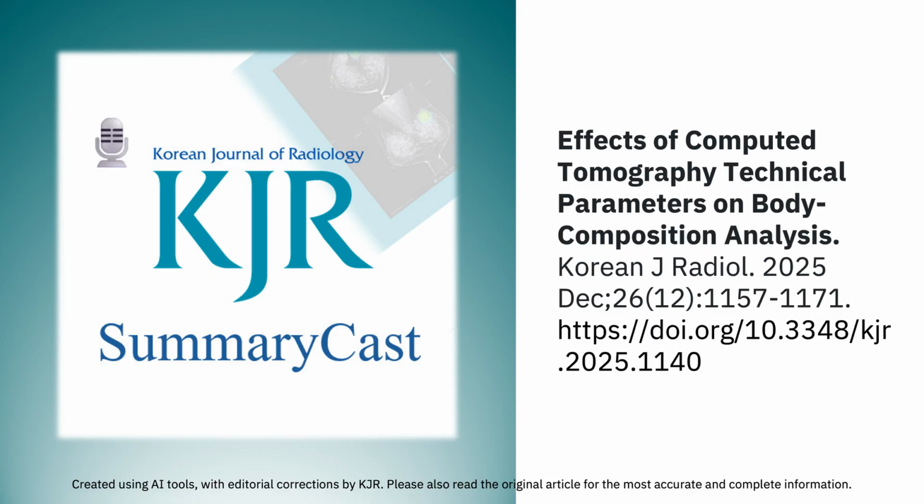The takeaway seems to be pick one phase and stick with it for any longitudinal analysis. Okay, let's move to another major factor, radiation dose, starting with tube current. Right, the mAs. The clinical push is always to lower the dose, which means lower mAs. But lower mAs means more image noise. How does that noise ripple through to BCA metrics?